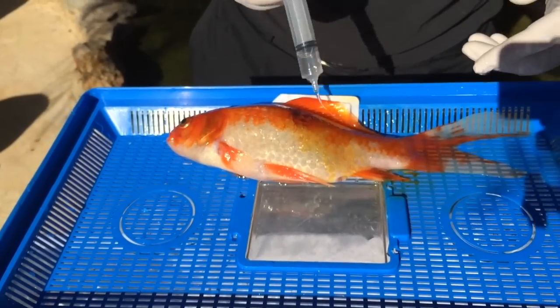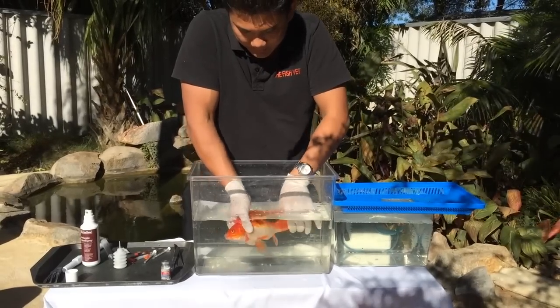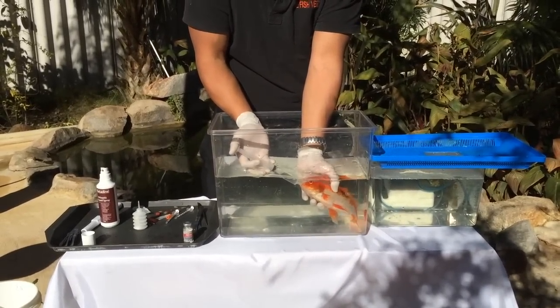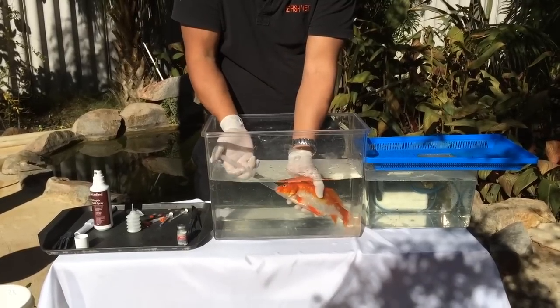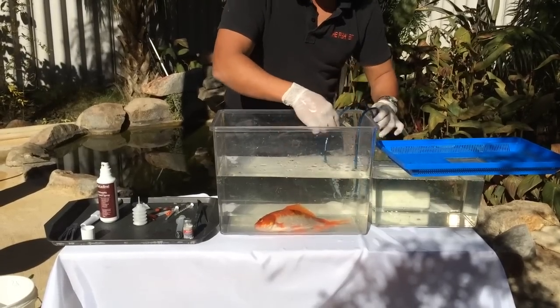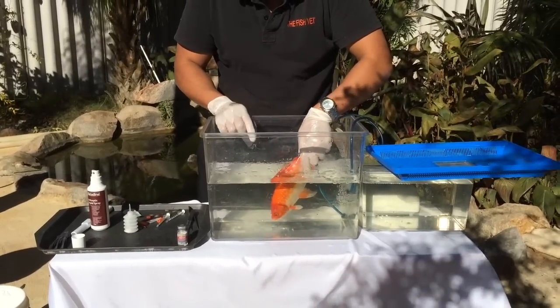Just give him a quick drench over with some clean water. Now we're just going to pick Bruce up and put him back into the water. You can actually try and revive him either by moving him back and forth through the water like this, or you can use a syringe and pump water through his mouth, or if it's a big enough fish you can use a powerhead and put it in front to pump water through. For really small fish where you can't handle them with two hands, sometimes you can jiggle them like a tea bag up and down.